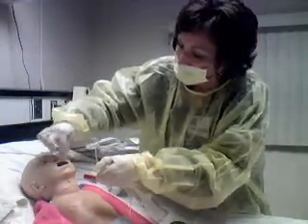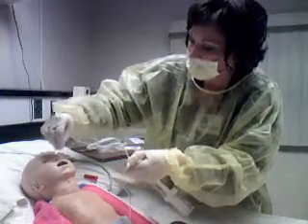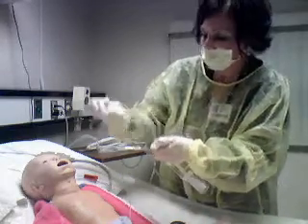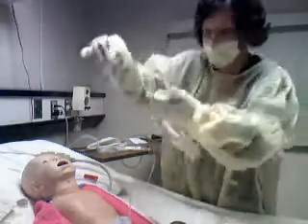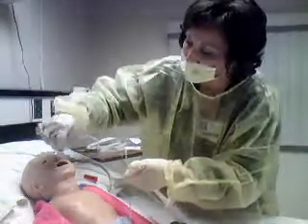Notice how I circle it around as I withdraw. You can't see it in here, but there is some accumulation of specimen within the tubing. We'll go down the other side.